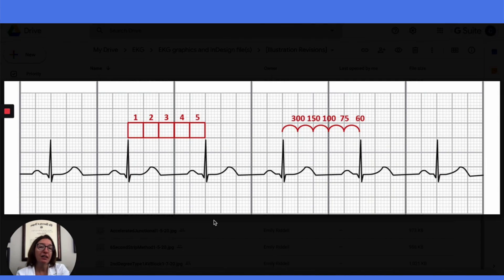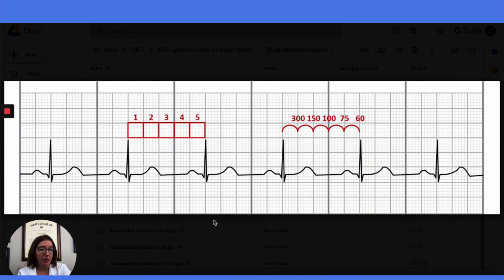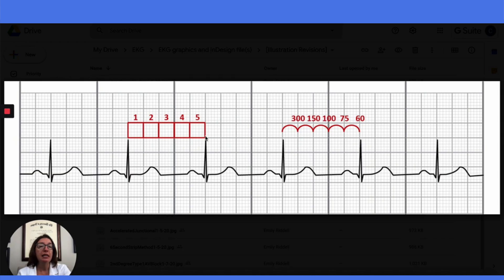Now let's talk about the second way of calculating heart rate, which is the big block method. This should only be used for regular rhythms, just like the small box method. I personally prefer the small box method because it is more accurate. However, a lot of people use the big block method because it is quick, although not quite as accurate. With this method, we would count the number of big blocks between the R waves — in this case, 5 big blocks. Then we take 300 and divide it by 5, which gives us 60 beats per minute. There are 300 big boxes in a minute, which is why we divide 300 by the number of big boxes between the R waves.